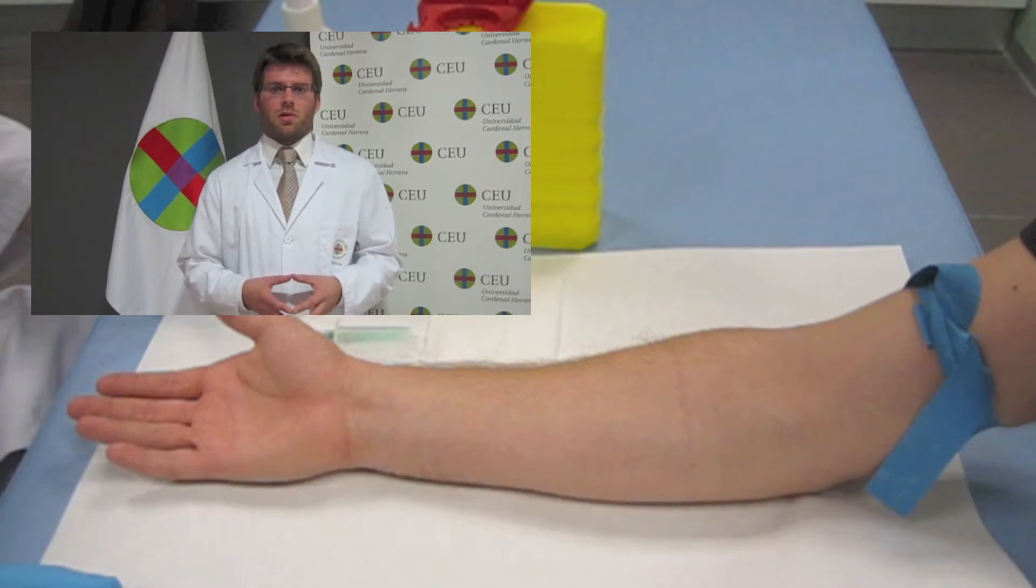Asimismo, ser impreciso en la punción o burgar con la aguja puede provocar la lisis de las células con el consiguiente aumento en la concentración de potasio.